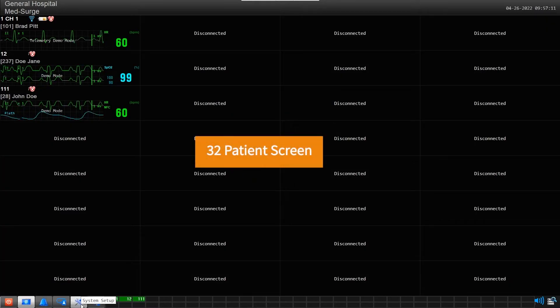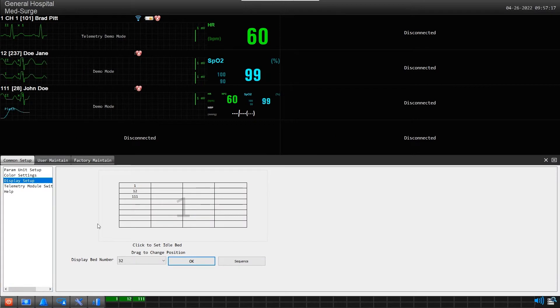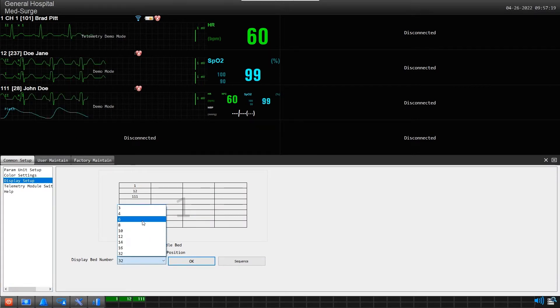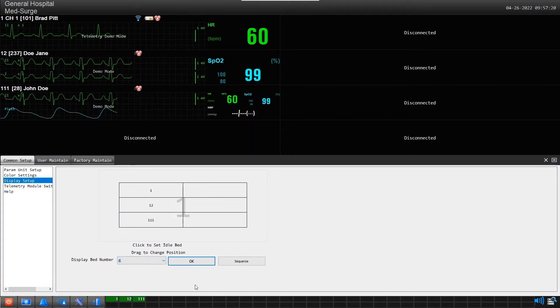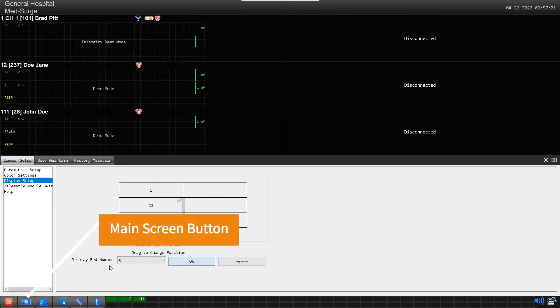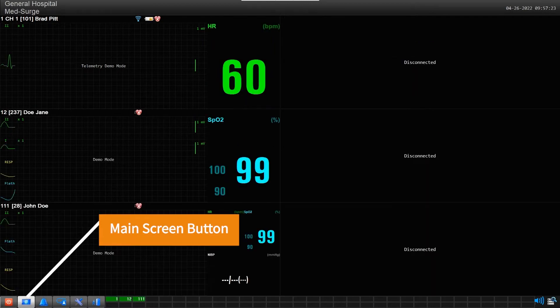But for our next example, we will change our screen to display 6 patients. Now click on main screen to lock in our selection and see the change display.